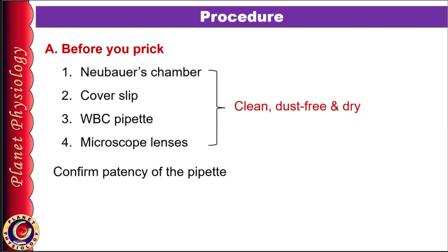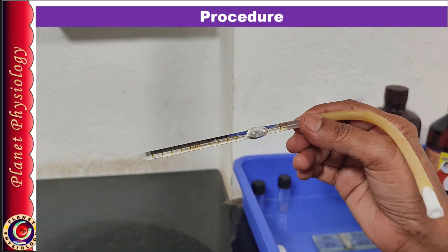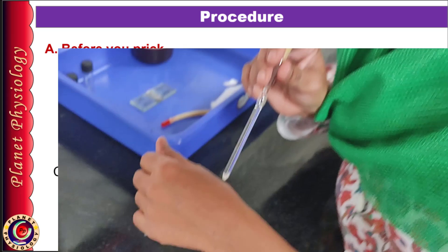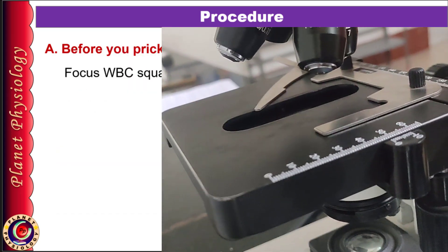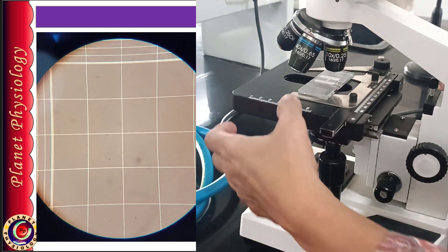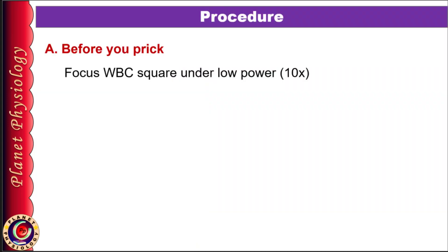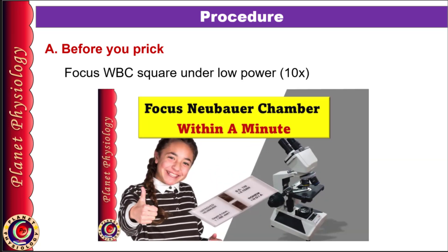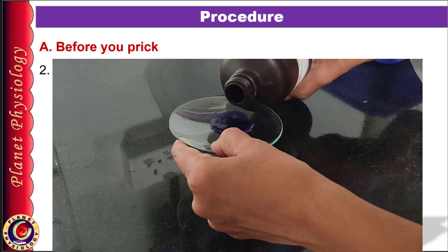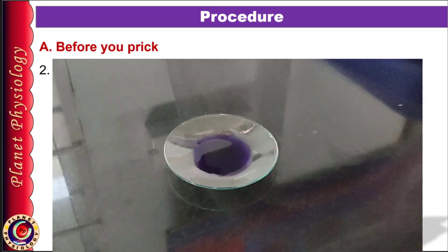Before taking the finger prick, ensure that the chamber, coverslip, and pipette are dry and clean. It is absolutely essential that all instruments, including the microscope, are clean and dust-free. Otherwise, dust particles can interfere with WBC counting and result in a falsely elevated count. Also, check the patency of the pipette by blowing through it — if you feel an air current on the back of your hand, the pipette is patent. Now focus the WBC square under the low power 10x objective and confirm it is clean, then remove it without disturbing any microscope settings. This saves time when you are ready with the sample. Now take adequate WBC diluting fluid in a watch glass. This is an essential step before taking the finger prick, which can prevent your blood from clotting within the pipette.